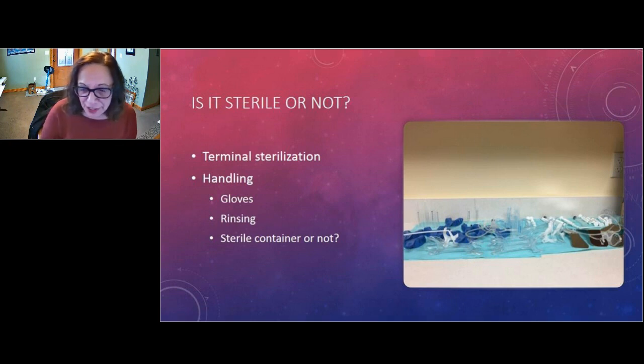This picture is actually from a practice I visited. These items were actually all being soaked in a cold chemical sterilant. A lot of those items were being used by orthopedics. It was a very large practice, and orthopedics traveled in periodically. So they would go ahead and manage all the soaking.